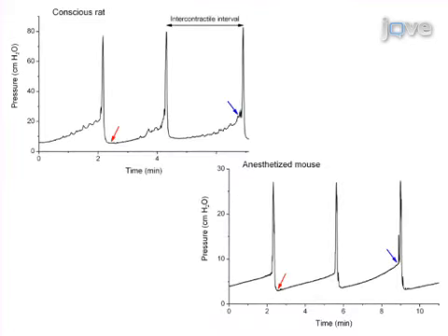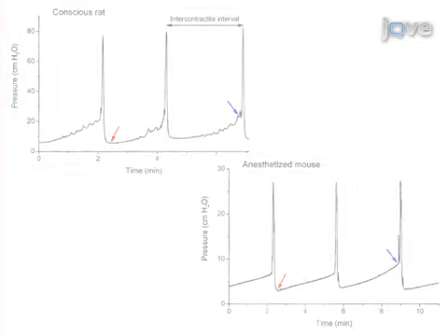Ultimately, results can show how irritant chemicals alter the voiding pattern through the analyses of the voiding frequency. The main advantage of this technique over existing methods, like the recording of the contractility of the isolated bladder, is that the function of this organ can be studied in more physiological conditions. For instance, the regulatory actions of the central nervous system are preserved.